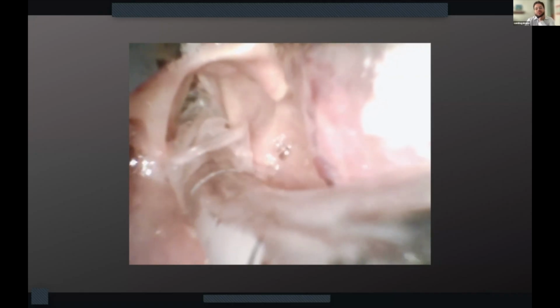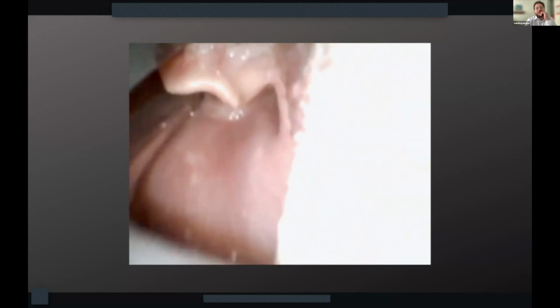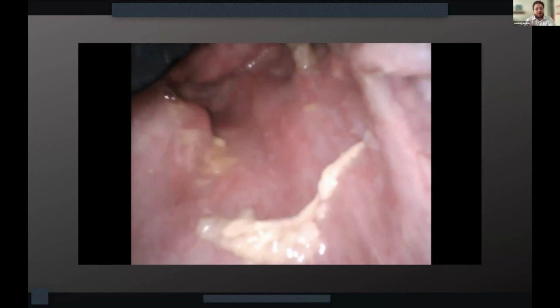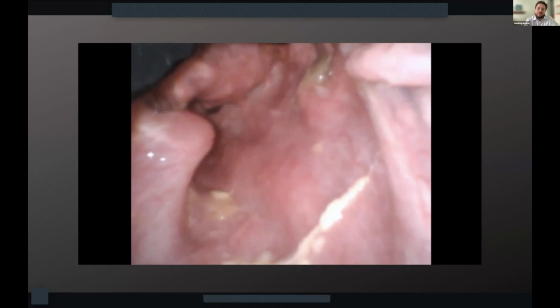And now when our ET tube comes in, it hits the top of that trachea, and we have a little bit of trouble pushing it through. Now the rigid stylet comes out, but the balloon I assume goes through, but we don't see it actually go past. Here's another example.